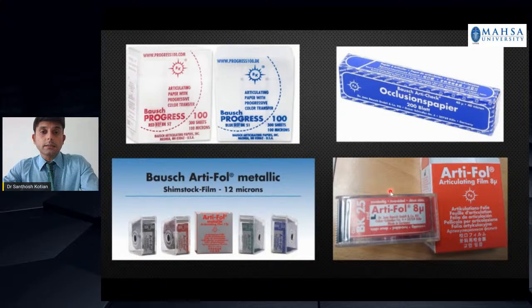Use the articulating papers for occlusal contacts. There are different thicknesses of articulating papers available. They range from 100 to 40 to 8 to 12 microns, depending on what you are using them for. For complete dentures and partial dentures, we normally use a thicker articulating paper, about 40 to 100 microns.